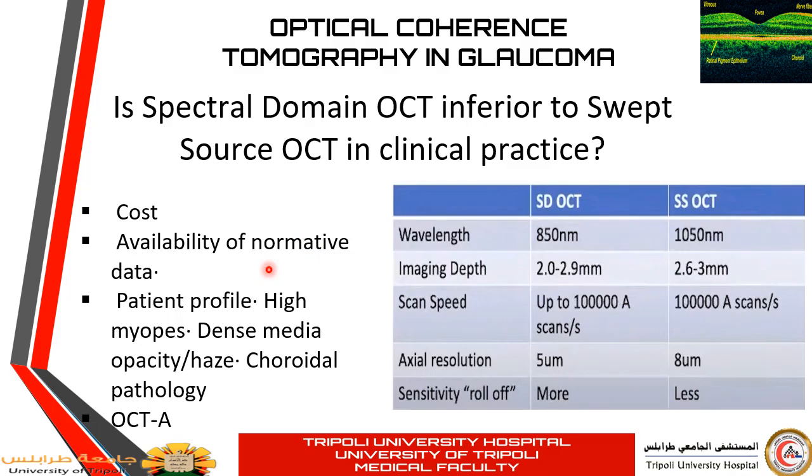And the swept source is superior to spectral domain in some aspects. For example, in cases of high myopia, in which the scan width and the scan depth are very important, especially in cases of posterior staphyloma. So studying the pathology of myopia is better with the swept source. Also in the presence of media opacity, especially in cases of post-vitrectomy where there is gas injected inside the eye. So in the immediate post-op period, for detailed visualization of the retina, the swept source is much better than spectral domain.